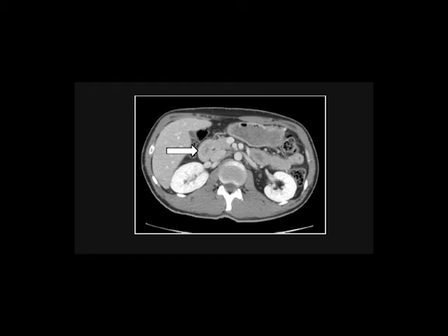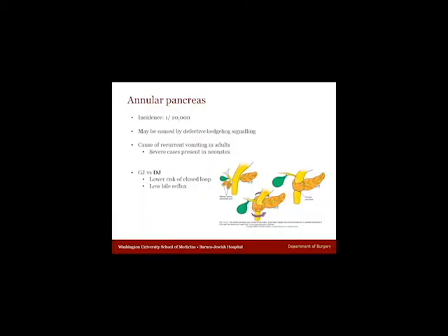Note the proximal dilated stomach. Annular pancreas is a relatively rare abnormality and a cause of recurrent vomiting in adults. It is an embryological abnormality caused by defective migration of the ventral pancreatic bud, which then envelops the second part of the duodenum.